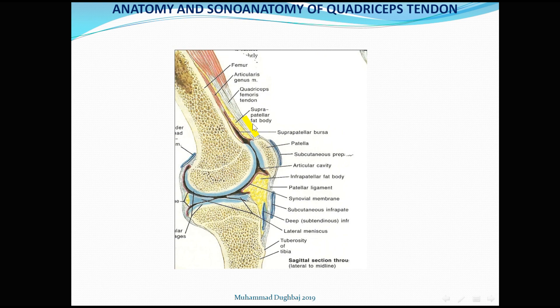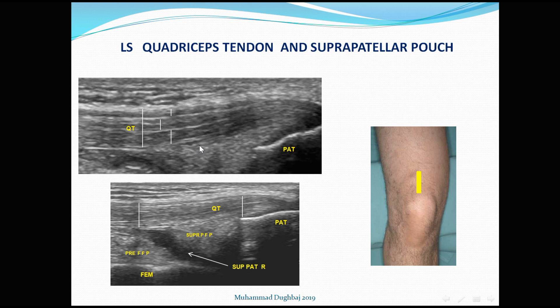In the long sagittal section we have the suprapatellar soft tissue, which includes the suprapatellar fat pad, the pre-femoral fat pad, the suprapatellar bursa, the articularis genus muscle, and the infrapatellar fat pad body with the deep and superficial bursa. Superior to the pre-femoral fat pad is the suprapatellar bursa and the articularis genus muscle.